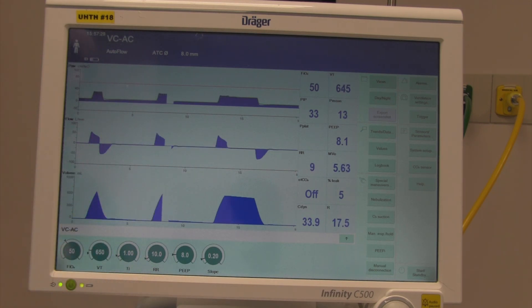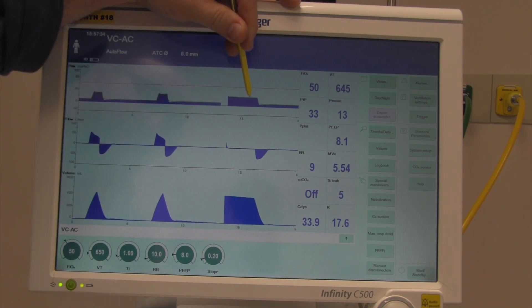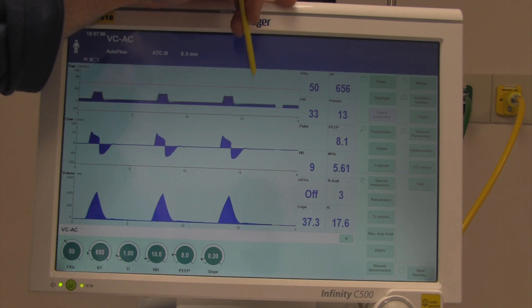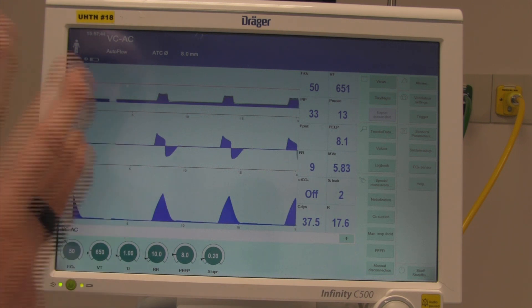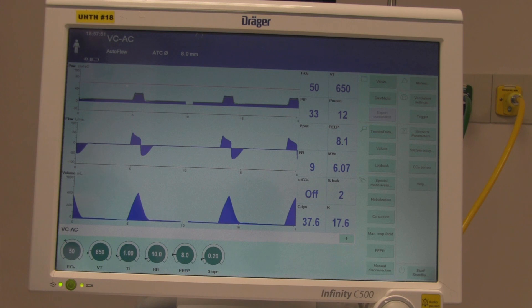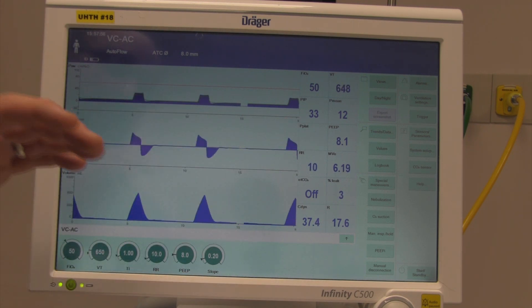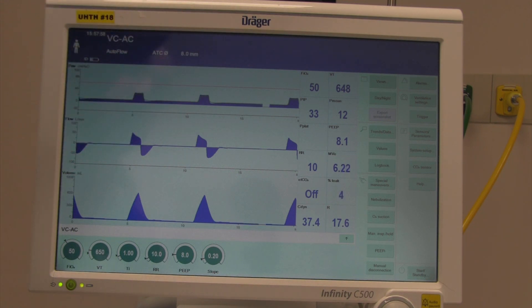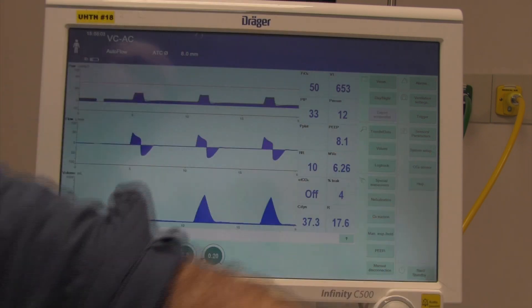After the next breath, it will calculate a plateau pressure — it goes away after that next breath. What you're calculating is how much pressure it takes to hold the lungs at the plateau, or as I think of it, in a static, still state. With ARDS or other lung disease causing stiffness, you'll see it show up in the plateau pressure — it creeps up over time and then improves as ARDS decreases.